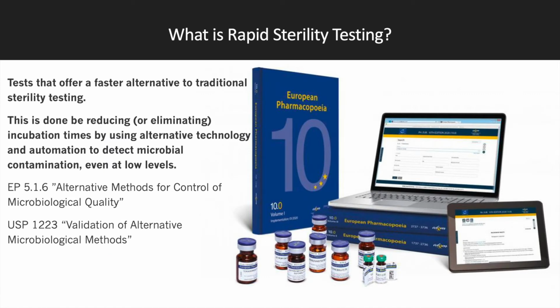So what is rapid sterility testing? Well, these are tests that offer a faster alternative to traditional sterility testing. Rapid sterility testing methods work by reducing or even eliminating incubation times by using modern technology and automation to detect the presence of microbial contamination.